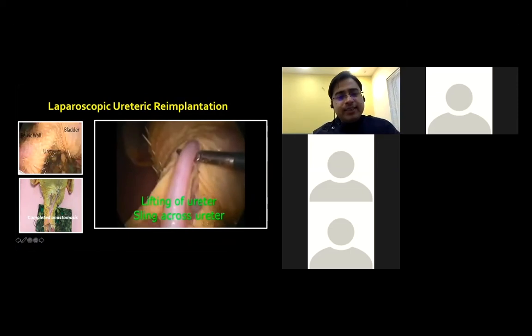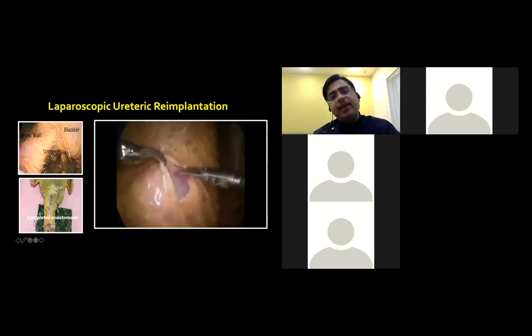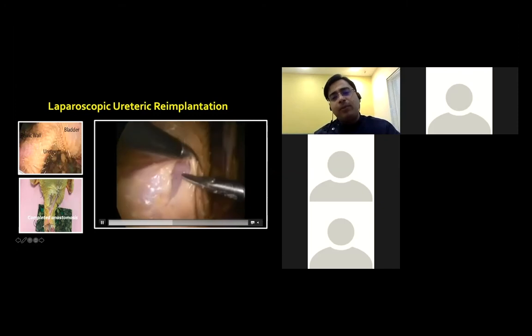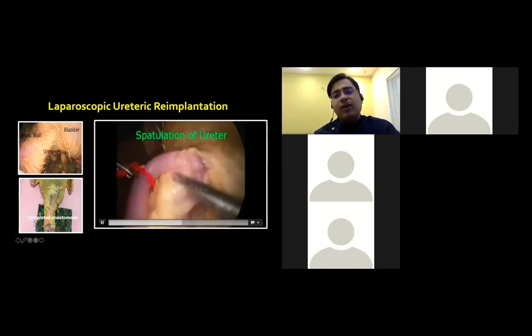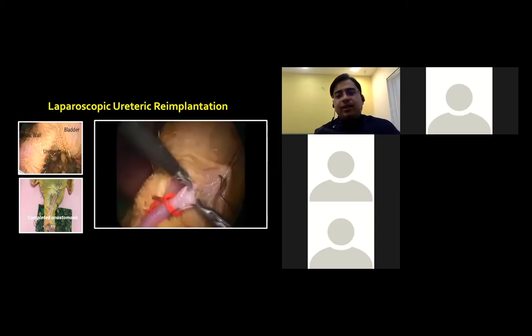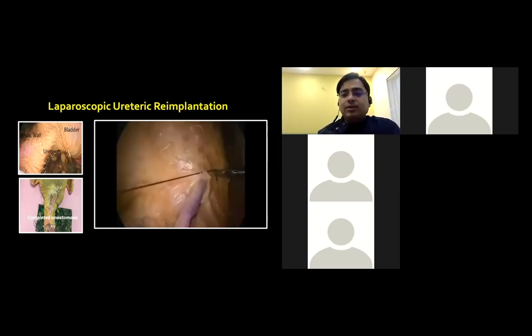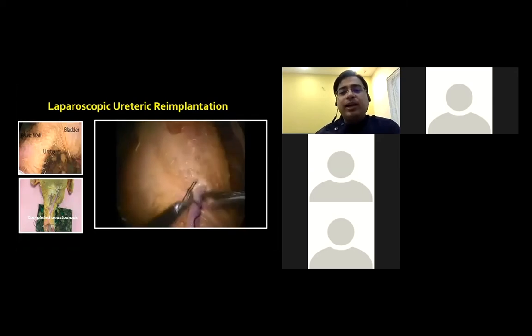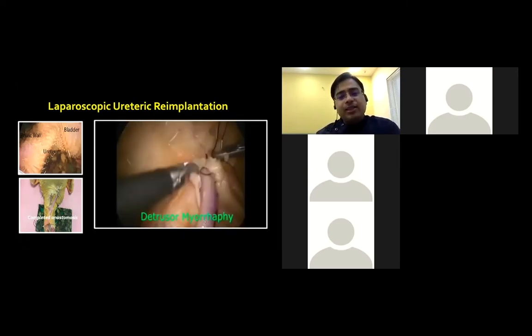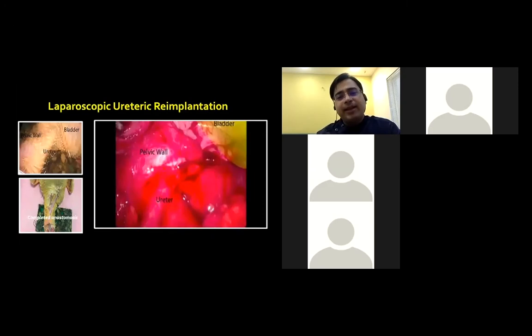Then this time you dissect the ureter, which will be the trachea, and then you take an incision over the crop, dissect the skin all around, and the blue hue will represent the bladder. Then you do the suturing and then close the crop skin like you would do the detrusorrhaphy. So this model will quite closely resemble a ureteric reimplantation model.